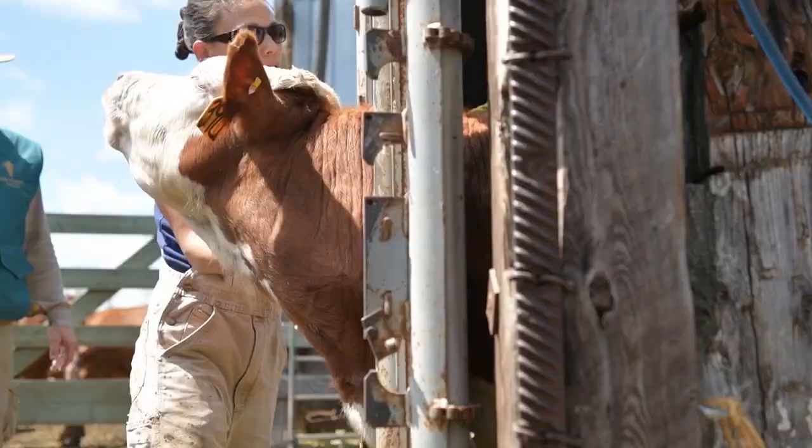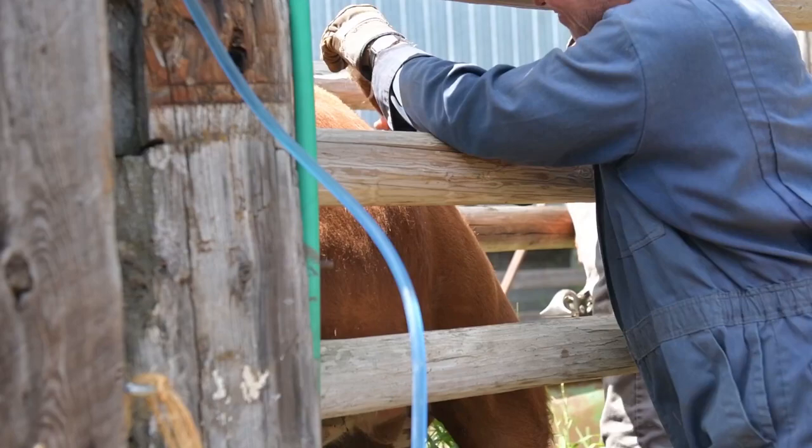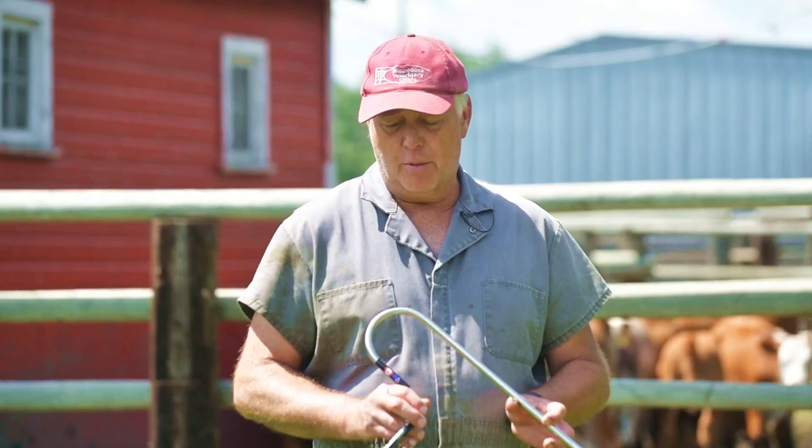I work in an office with two other mixed animal veterinarians and three veterinary technicians who assist in our handling of livestock on a daily basis. I would be remiss if I said that everything I suggested to my staff they took hold of without their own proof of it. What I can say with 100% certainty is that the use of this particular instrument has been successful in the hands of everyone in my office, to the point where they all are very much in tune with what it'll do for them.